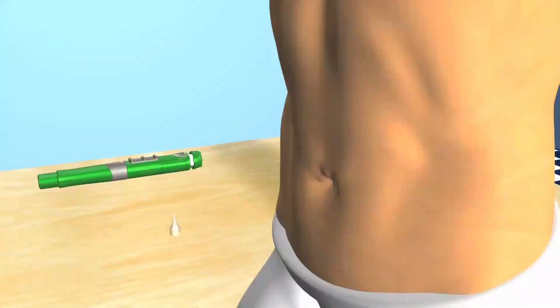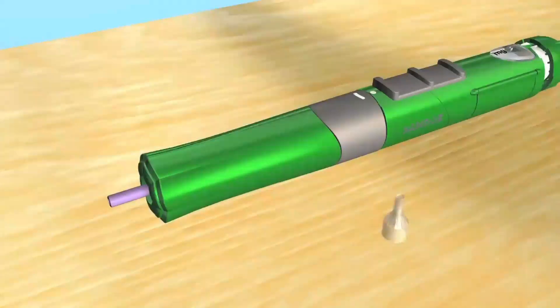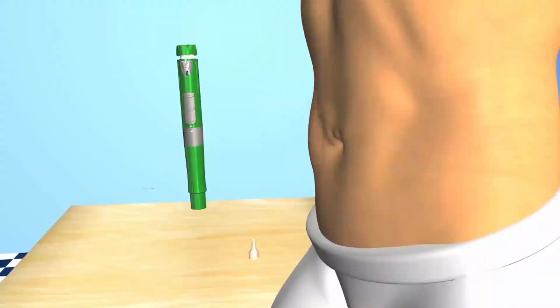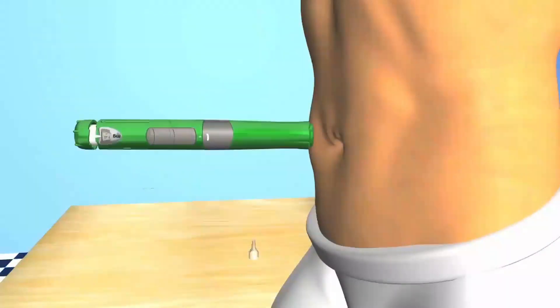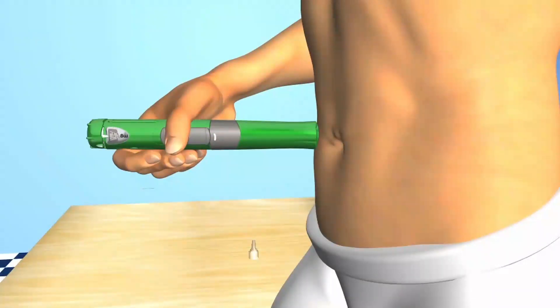When the right dose is loaded, put the SurePal down and get a disinfectant swab. Select an injection site and clean it with disinfectant — use a different site each time you inject. If you're using the needle hider, pull the sliding sleeve back with your thumb and finger, then pinch the inner needle cap and pull it off and throw it away. Pinch a fold of skin with one hand in the spot you cleaned, and push into the fold of skin. If you're using the needle hider, make sure the bottom moveable part is pushed all the way in. When the needle is inserted, push the sliding button down with your thumb. You'll see the dose knob turning. Hold the SurePal and the sliding button down for 10 seconds after the knob stops turning.